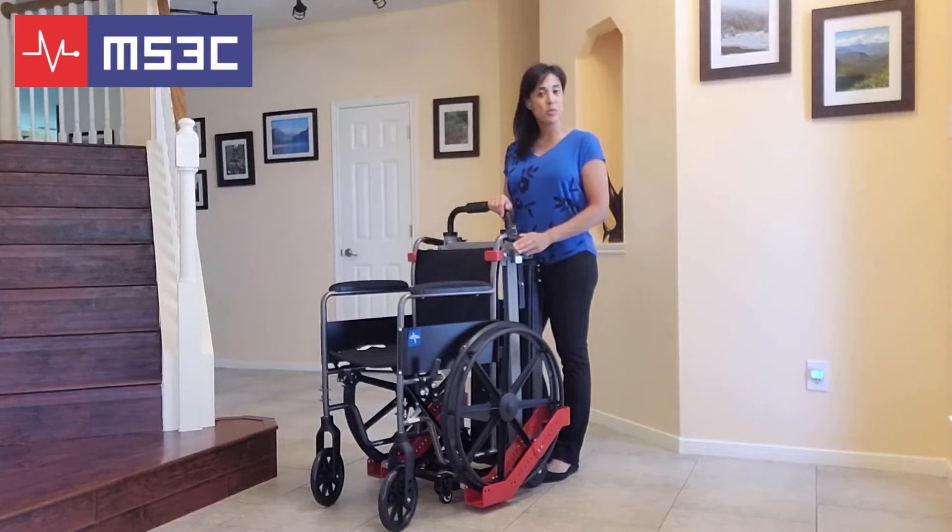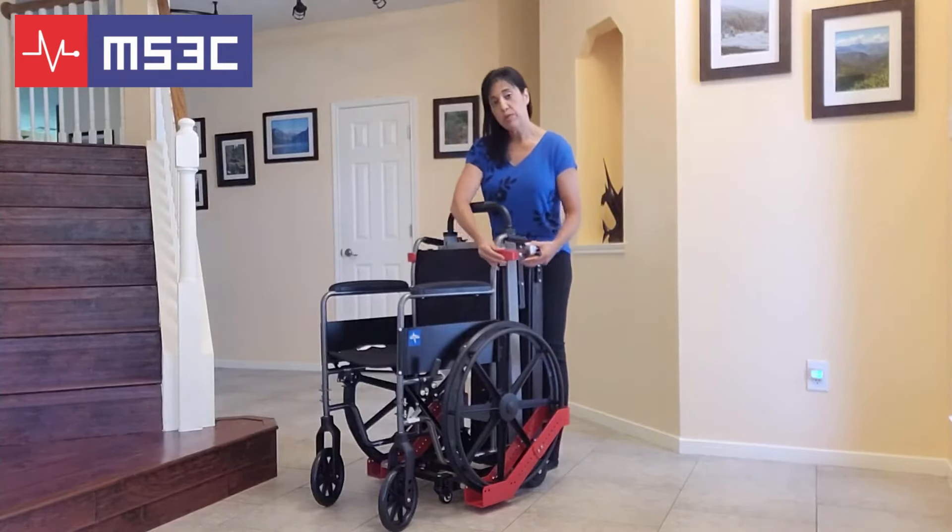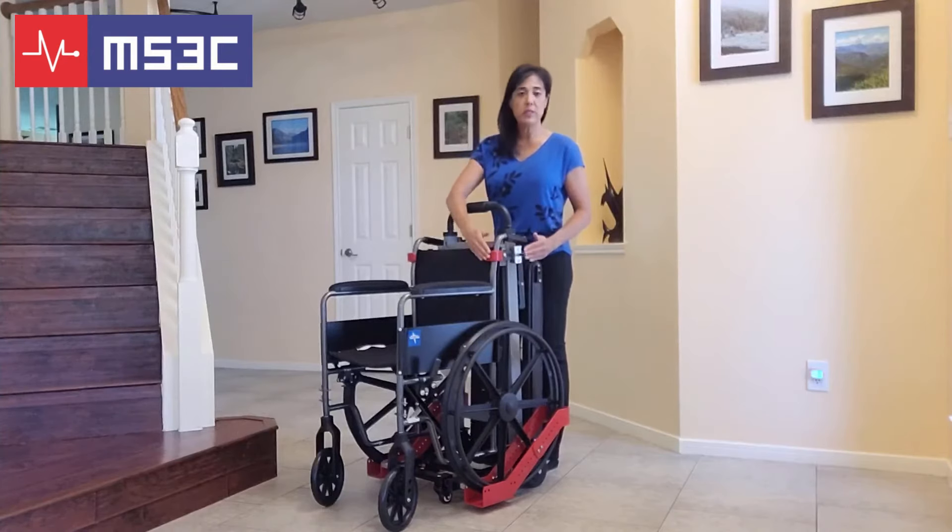The side supports on this trolley are adjustable in several ways. If you need to adjust the width of the side supports, twist the black knob in front of the chair and move in or out. You will want this arm to grab the back of your wheelchair. Once it's in place, tighten it. If you need this arm to go in or out, you can pull the knob on the side and adjust it front to back.